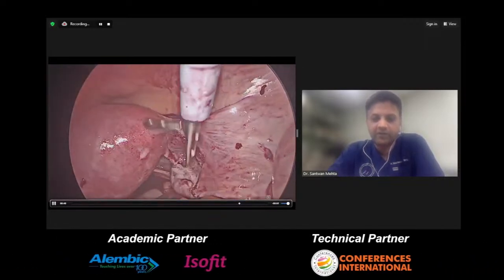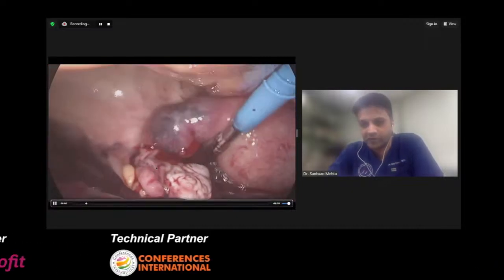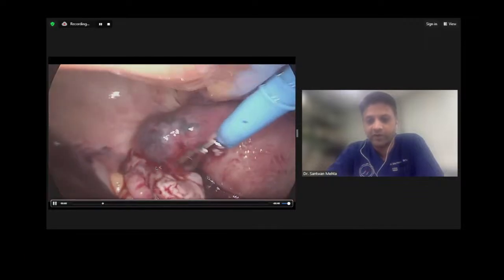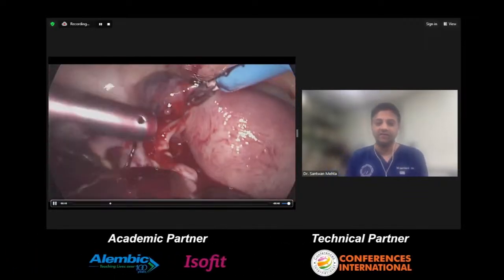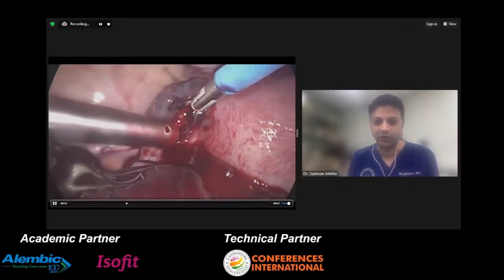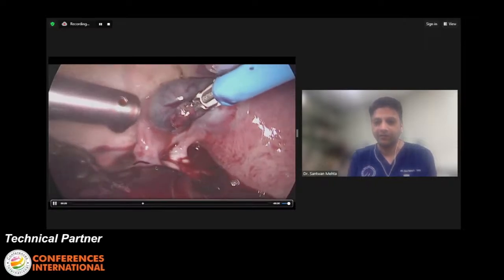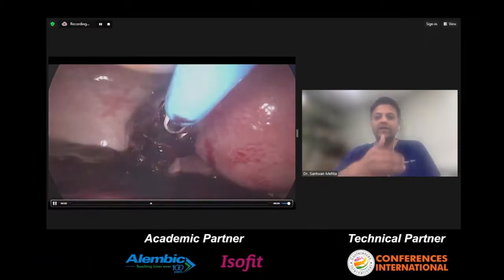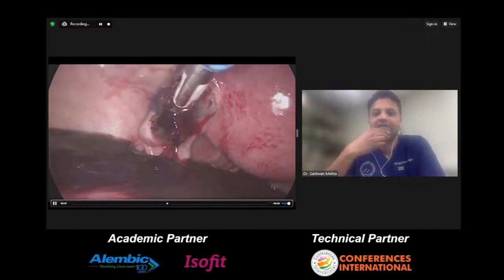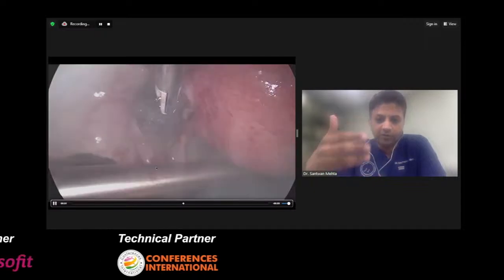But things become a little bit difficult when the ectopic pregnancy is more proximal, as in this case, where the tubal ectopic mass is nearer to the cornual pregnancy. So this is the tubal interstitial ectopic pregnancy. Dr. Nainika has also shown some good videos about the ectopic. The problem with this kind of ectopic pregnancy is that it's highly vascular, because the mass gets a dual blood supply, one from the uterus and the other from the ovarian vessels. So no matter how hard you try to cauterize, they will keep on bleeding.